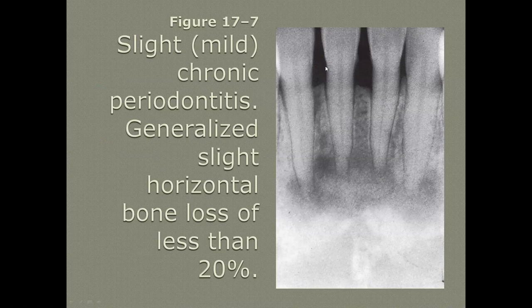This is showing slight periodontitis — you're looking at where the CEJ is, the bone should be about one to two millimeters from there, and then there's about one to two millimeters of bone loss from that point. Some might call it slight, some moderate — you both could be right. We take a look at the rest of the mouth, the patient's age, mobility, and any other distinguishing factors to make that determination.